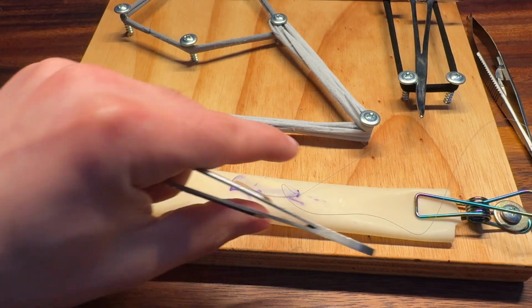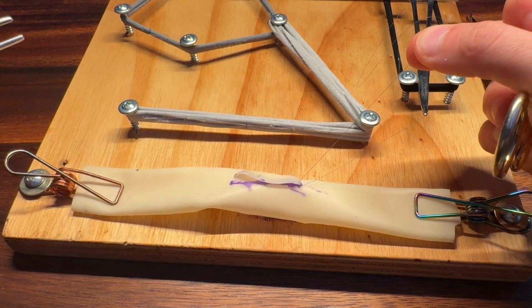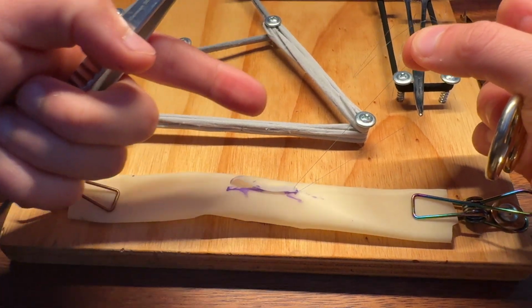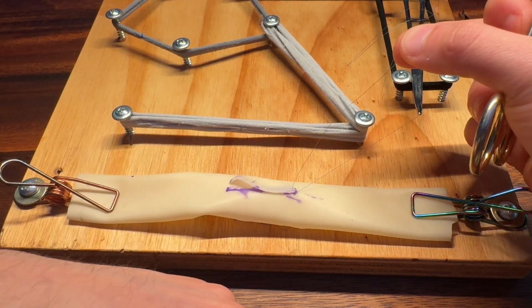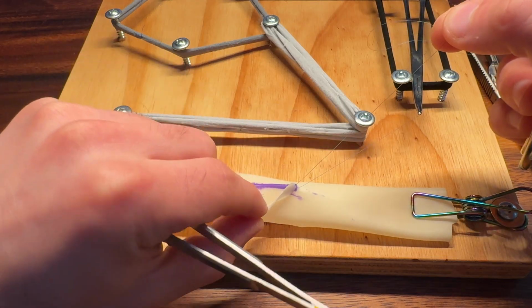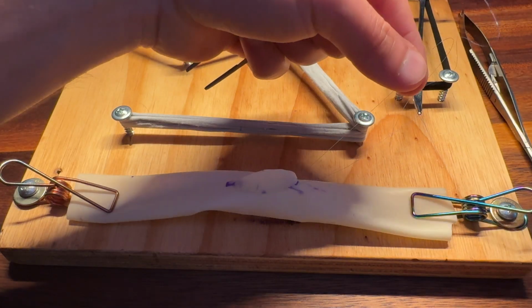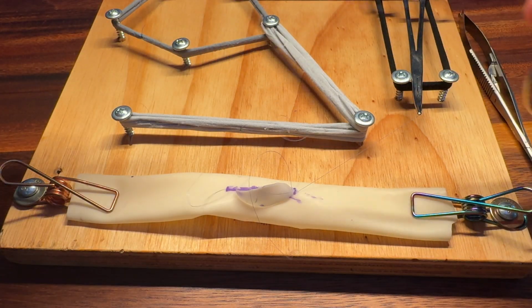So now that that's done, a lot of times in the OR you're going to have someone doing something like this, right? And that really allows you to see what you're doing, and it keeps the suture out of the way. It helps keep some sort of traction to make sure you can do your next throw easier. Since I don't have that, it's going to be a little bit more difficult.